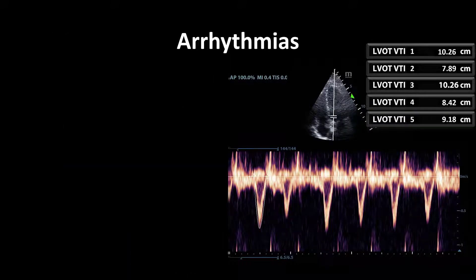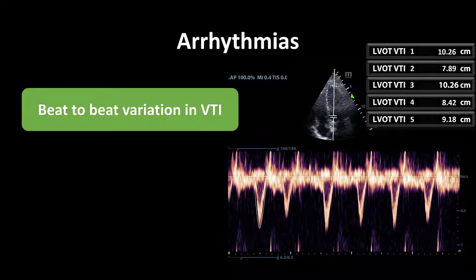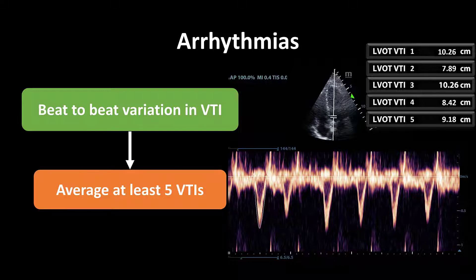Pitfall number four is arrhythmia. Common arrhythmias we encounter include atrial fibrillation or significant amounts of atrial ectopy. This can affect your VTI because there's beat-to-beat variation in the amount of stroke volume being generated. Thus, to get an accurate determination of a patient's stroke volume, it's best to average at least five VTIs.